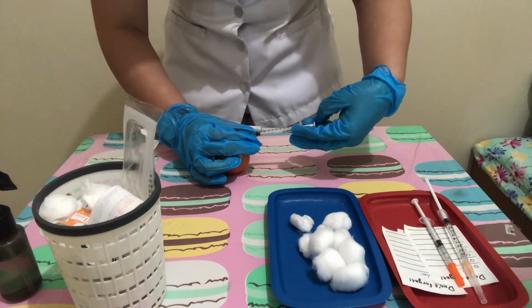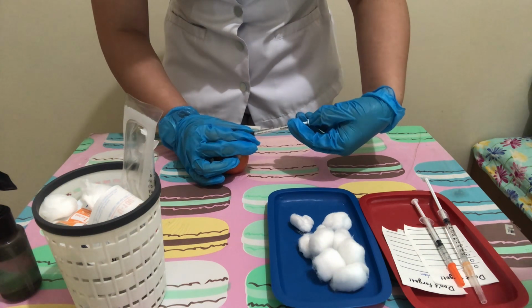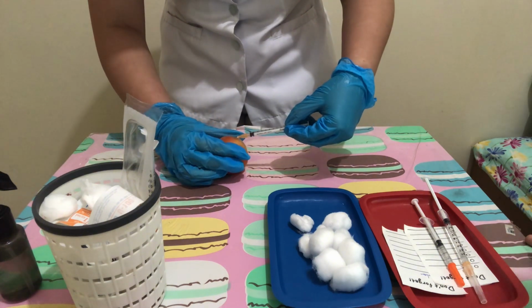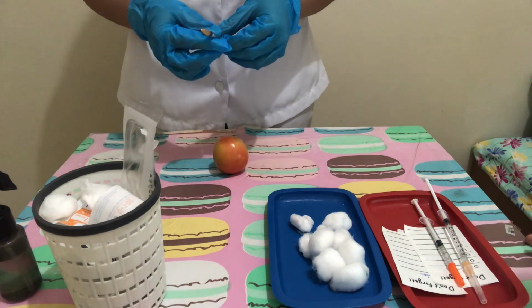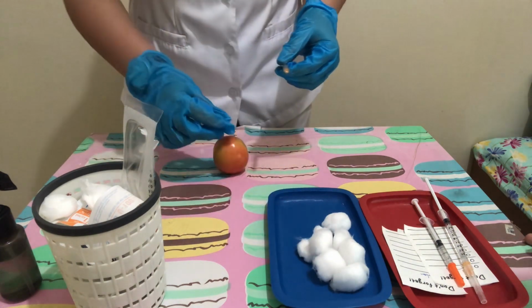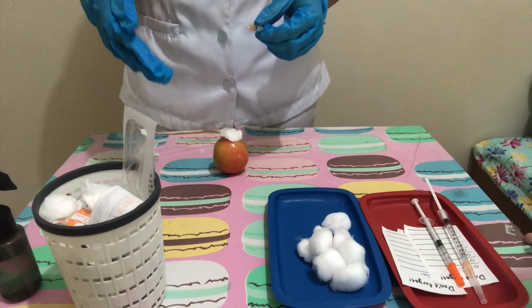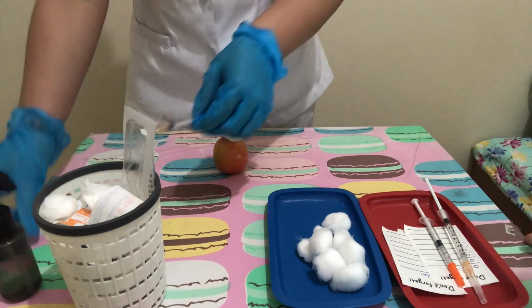Then stabilize the syringe and needle. And then inject the medication carefully and slowly so that it produces a small wheal on the skin. Then withdraw the needle quickly at the same angle at which it was inserted. And then apply a bandage and do not massage the area. And then circle the injection site with ink to observe for redness or induration.